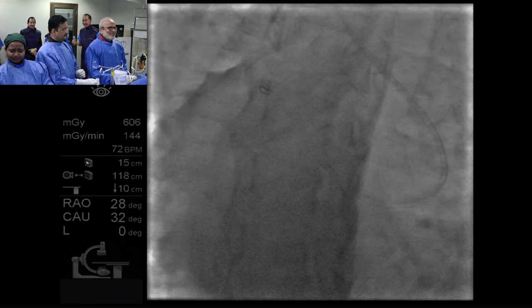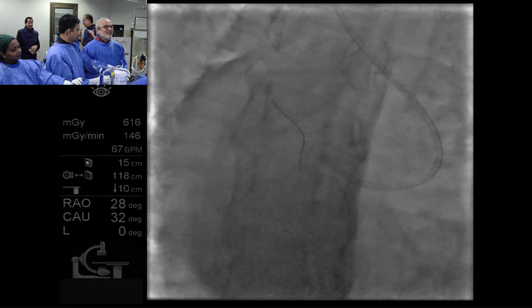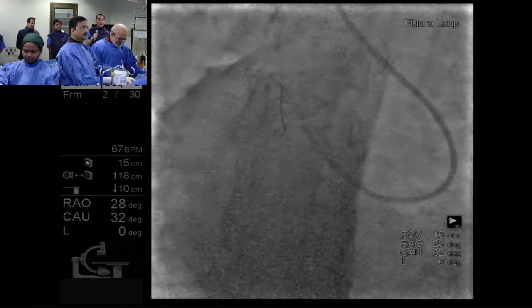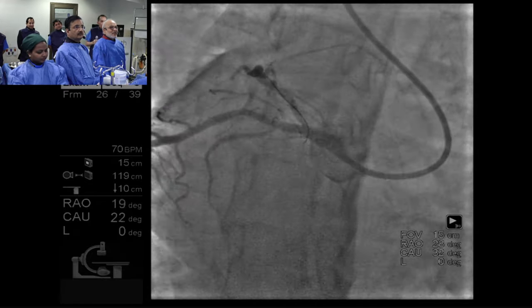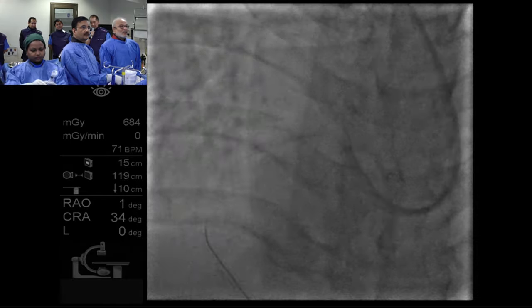Khaled and Malcolm, do you have anything to say on this? It is only two-dimensional. We need three-dimensional to see. Can we see a little contrast here to see if it recoiled? I think we need to adjust the wire in cranial view. I think there is some deep calcium because it recoils right away. That's a very good point.